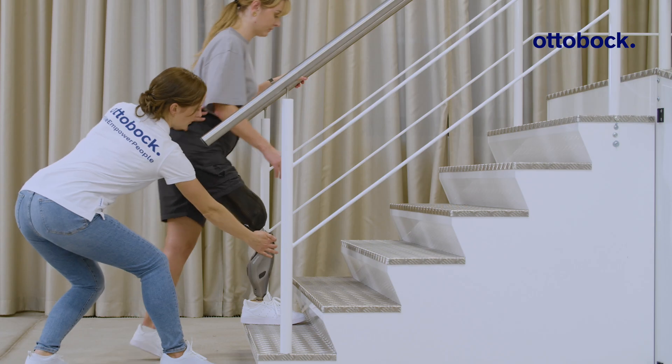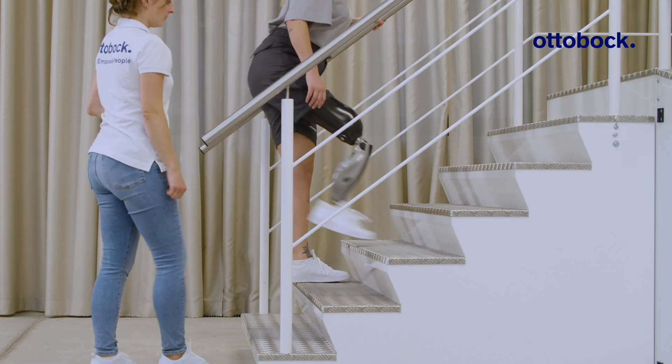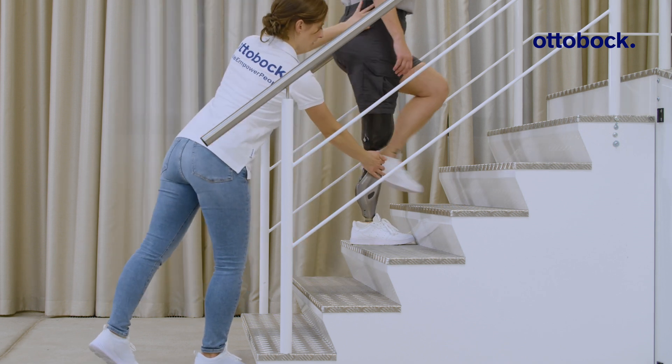Support foot placement and hip extension, and make sure you always stand next to the user and never behind.